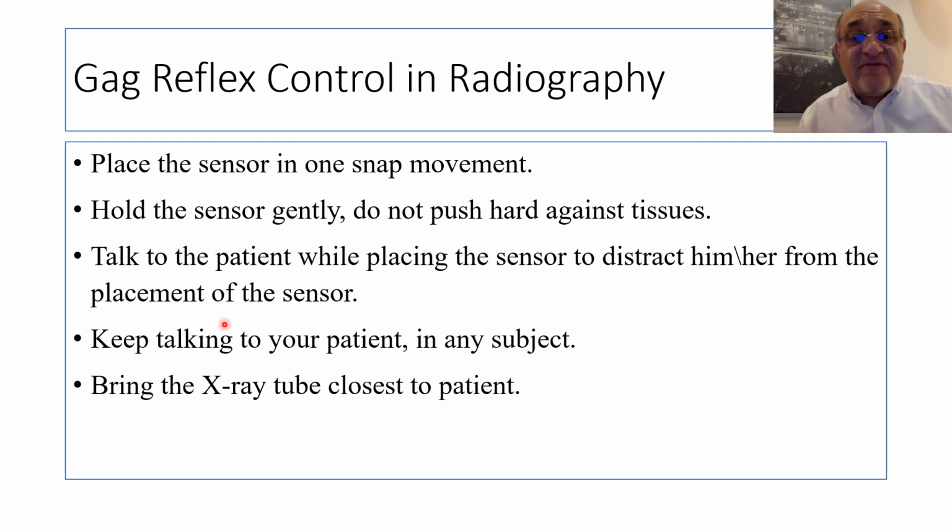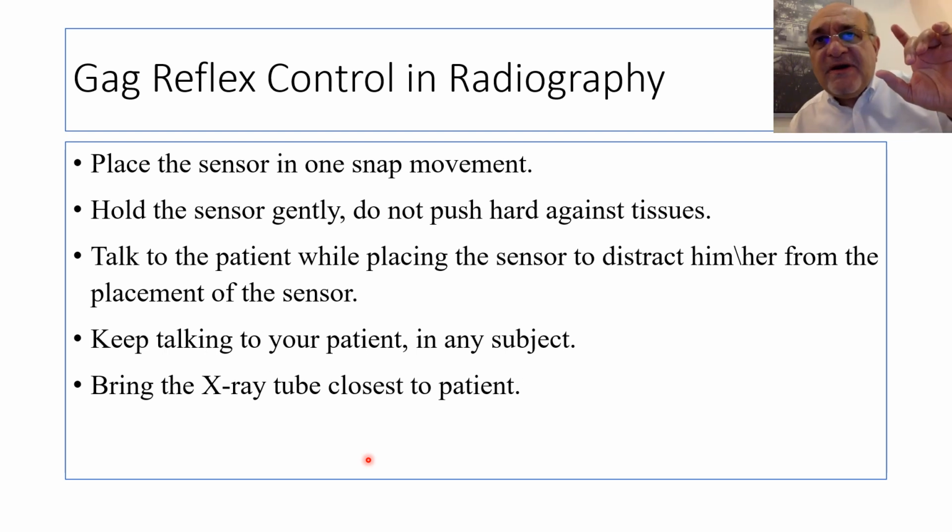And speaking of distraction, always talk to the patient while placing the sensor, so that you distract the patient. Any subject. Please open. Okay, very good. Even if he is not a child; this works with adults. The patient will be trying to comprehend what you're saying to him.